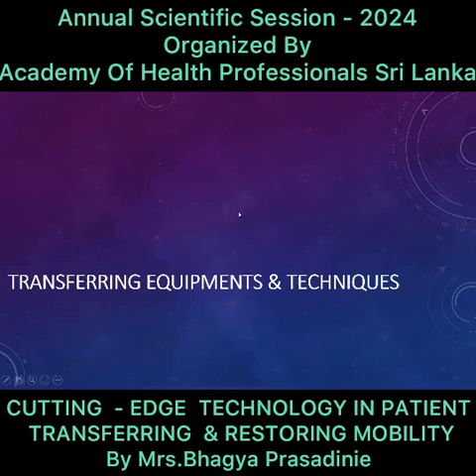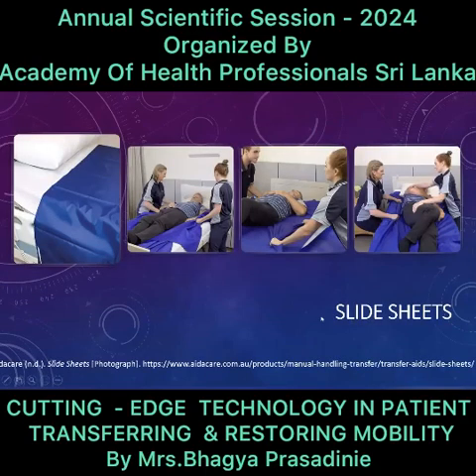Next we are moving on to the transferring equipment and techniques. First is slide sheets. I'm starting this section based on the dependence level, that is the assistance level, so I'm starting with the dependent part, maximal to moderate assistance. When a patient cannot move by himself, we use slide sheets to move the patient up and down on the bed. Sometimes we use slide sheets to transfer the patient to a trolley or another bed, in order to move the patient in a horizontal plane.